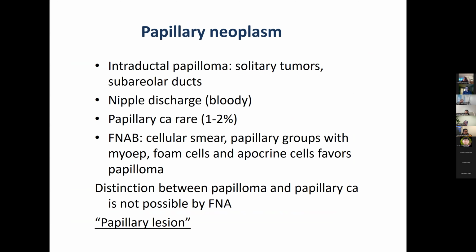Papillary neoplasms are very important to diagnose, so the patient can have appropriate follow-up and management. They usually present with nipple discharge, which is more often bloody with the malignant papillary lesions. And papillary carcinomas by themselves are very rare. The smears are very cellular, and they can be three-dimensional. You will see the whole spectrum, foam cells and apocrine cells, which just favors a regular papilloma.